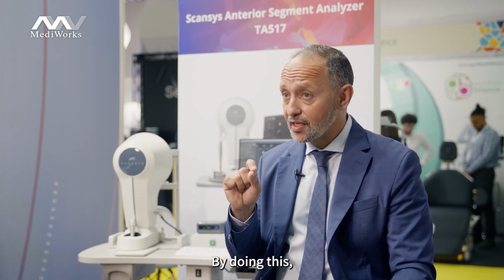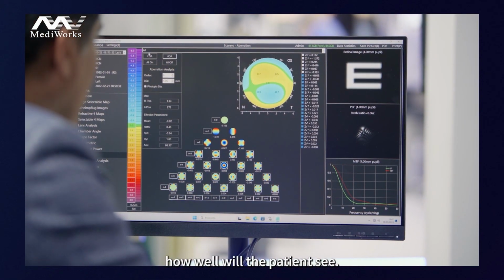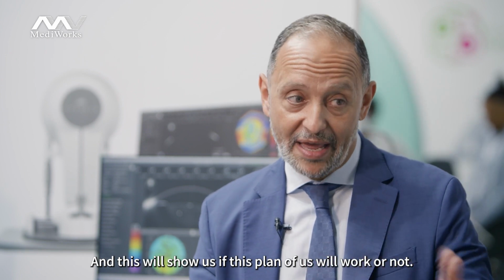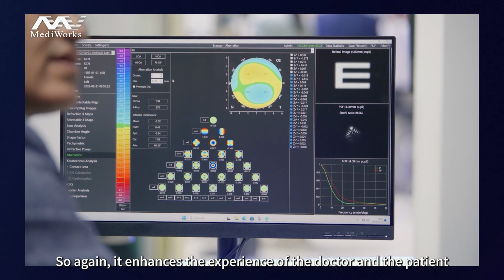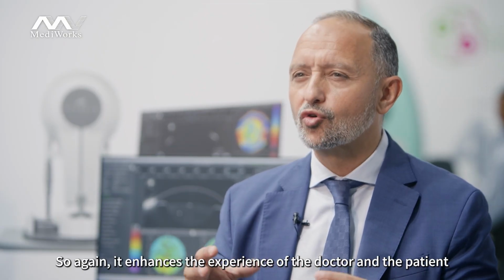By doing this, you can actually simulate, if you get rid of this higher order aberration, how well will the patient see. And this will show us if this plan of ours will work or not, number one. Number two, it will show the patient what's expected after the surgery. So again, it enhances the experience of the doctor and the patient when we are treating complex cases.